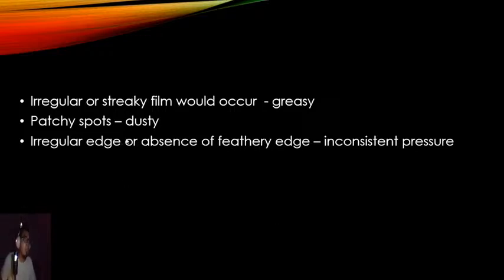And don't use dusty slides, of course. If you're going to get dusty slides, you can clean it with a cloth or a tissue. All right? And inconsistent pressure. So yun nga, inconsistent ang pressure mo, mas may force ka dito sa side na to. Mas maganda talaga yung version na ginagawa ng friend ko na isang slide lang. Kasi usually merong inconsistency sa pressure. Alright? Constant lang.